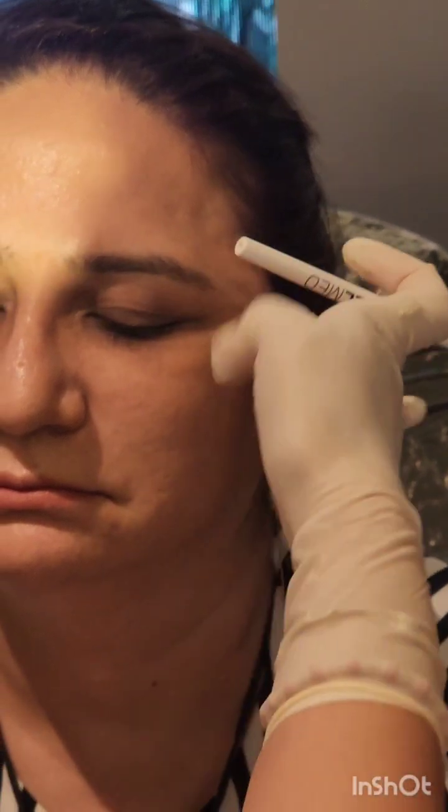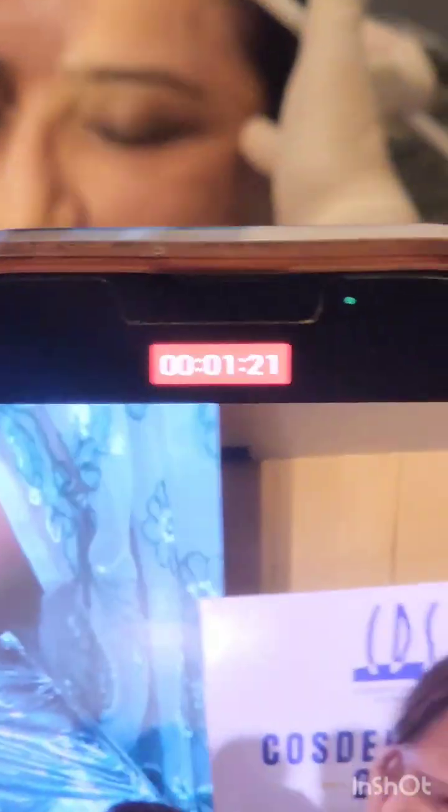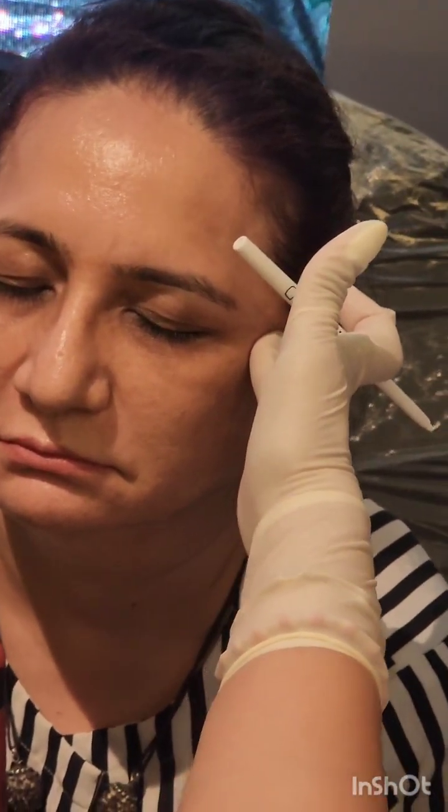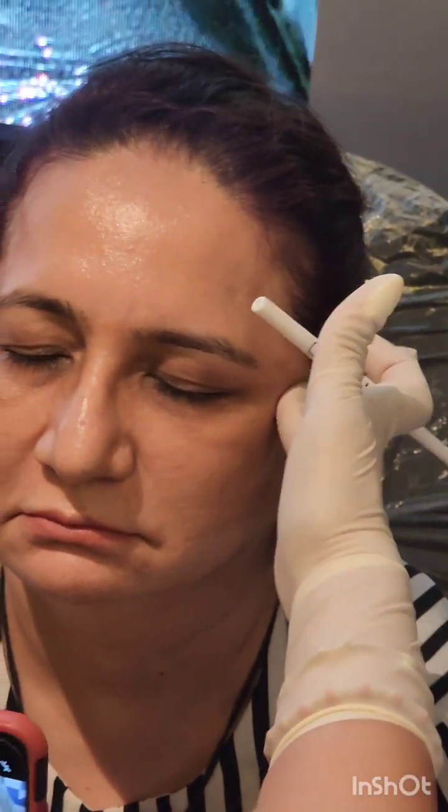So we have to choose a point where we can introduce the maximum length of the needle, the thread, with maximum effect, and that will come around here. See, can you see that? From here, you're introducing almost like 6 to 7 centimeter of your thread, and you are getting a good effect. All right. So this becomes our entry point.